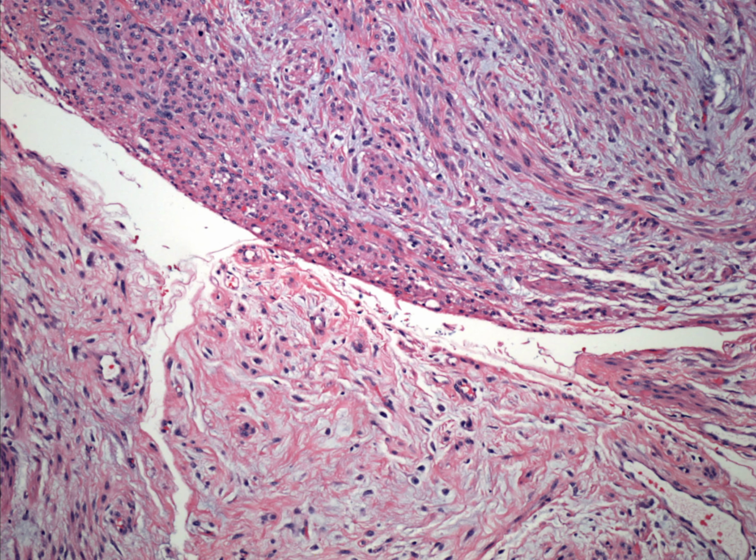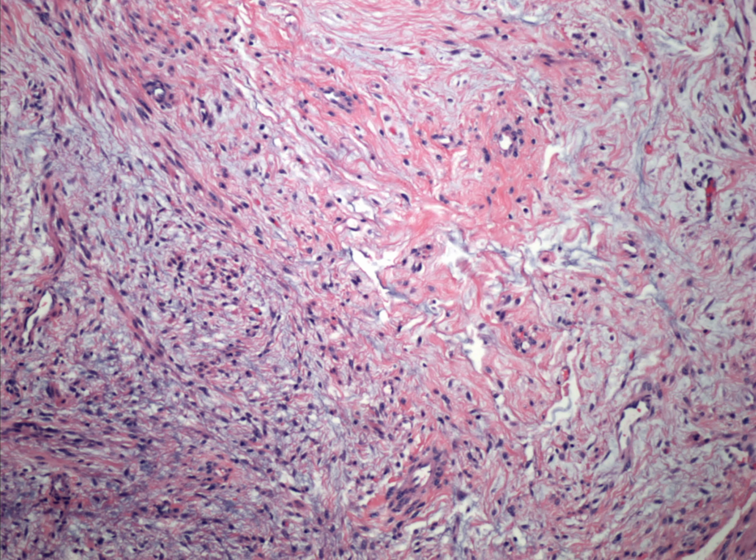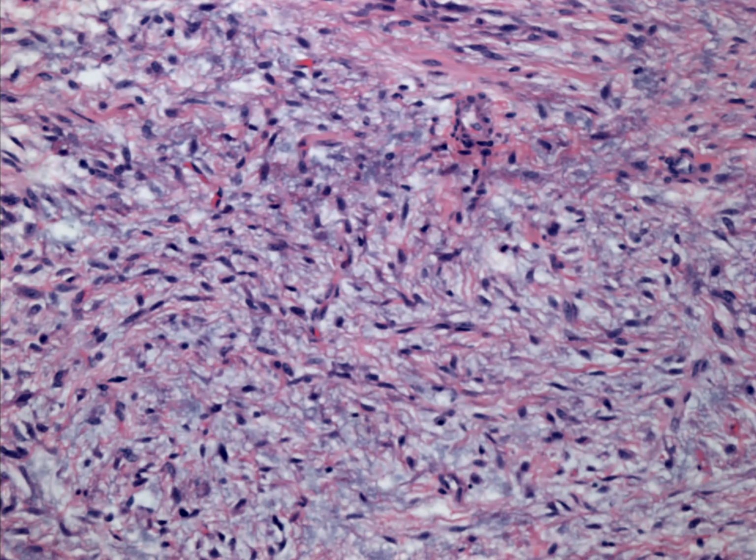This is another area, though, where you can start to see that in some of those areas, the more cellular at the top of the screen and the less cellular, it does appear that there is actual mucin between the cells, which is interesting. And once you get into that differential diagnosis with spindle cell lesions, you're in a little bit of a different category. And this is another high power view of the areas showing mucinous differentiation. However, the histology, the cytomorphology is pretty benign.